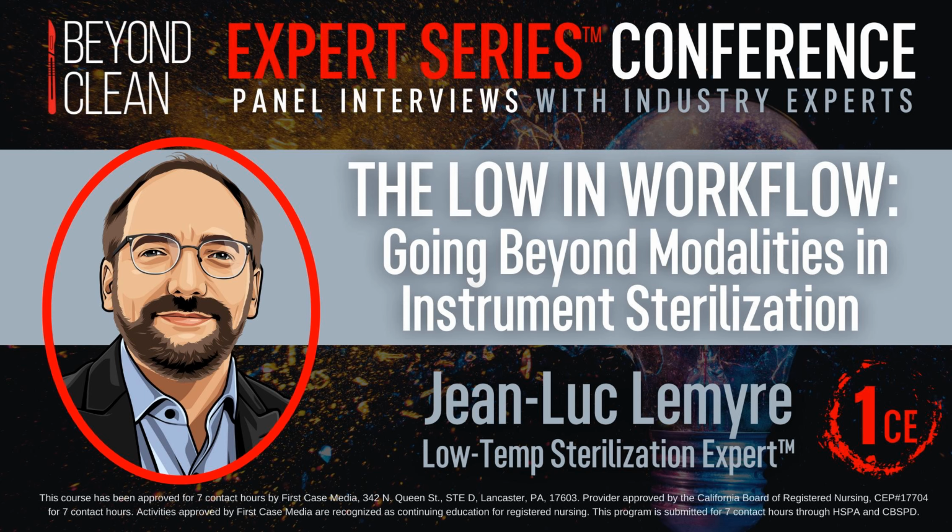Then we vacuum the chamber. So the pump starts again, removes everything, the peroxide, the water. There's always water there too because it's a mixture. And any byproduct gets removed by the pump. This goes through a catalyst. As we mentioned, we don't want peroxide to go out of the chamber as is, so it goes through a catalyst to break it down into water vapor and oxygen.